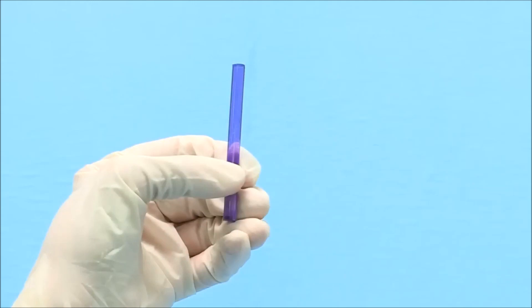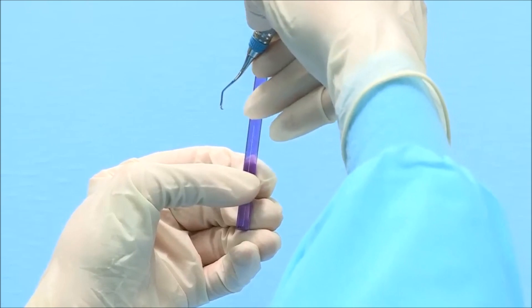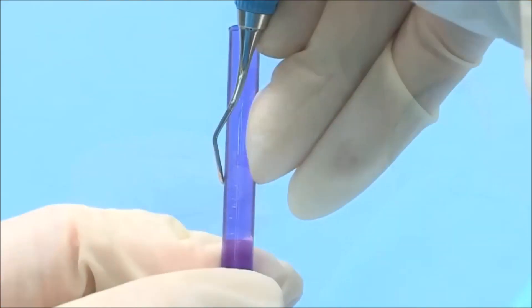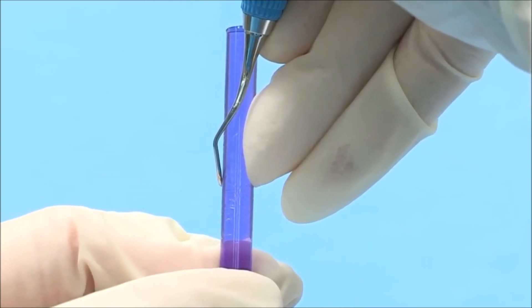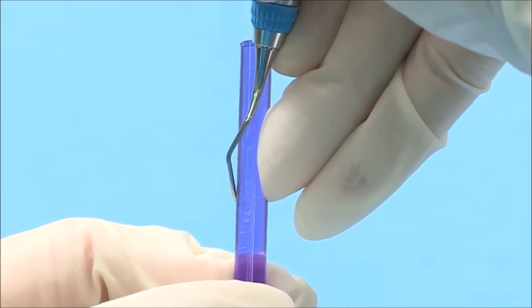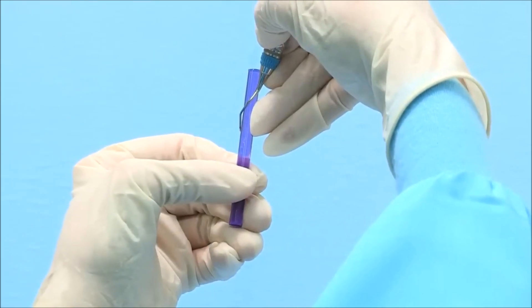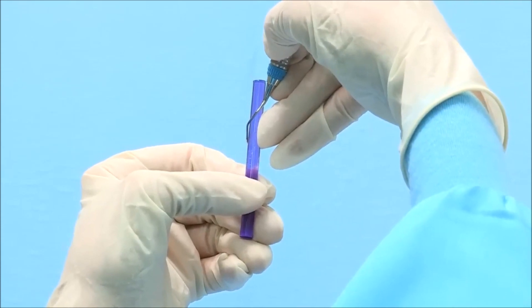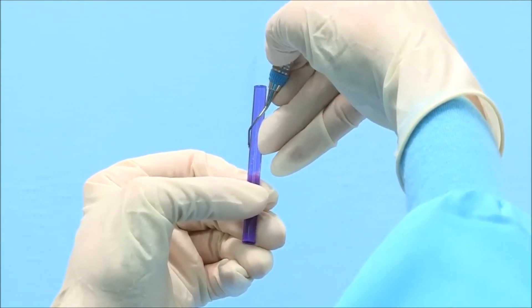Testing Gracie Curettes for sharpness is extremely easy because the downward slope of the blade automatically positions the cutting edge at the correct position on the test stick. The position for the terminal shank of the Gracie Curette and the test stick will both be at 12 o'clock. In your dominant hand, hold the instrument with a modified pen grasp. For even-numbered working ends, the toe will be pointed away from you.